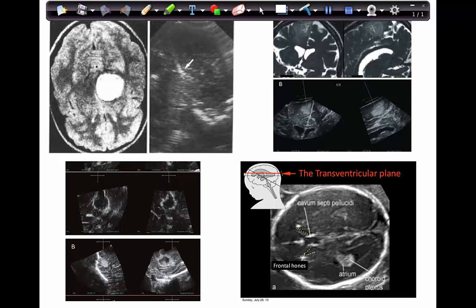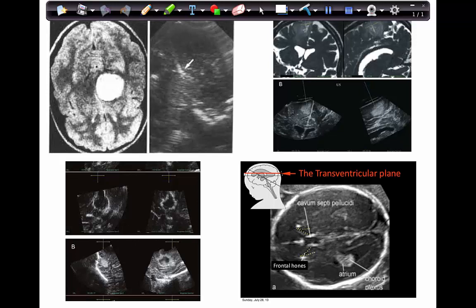In a small infant with an open fontanelle you can beautifully see the anatomy — ventricles, midline, any lesion, even the choroid plexus. You can also nicely differentiate various areas of a tumor and correlate with the MRI scan, making it easy to target your biopsy, safely avoid the midline, avoid entering too deeply, take accurate biopsies, and even watch for complications like bleeding. In adults, make a small craniotomy and use your ultrasound probe as a very effective guidance system for biopsies.